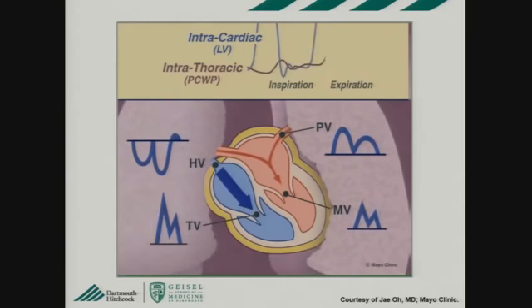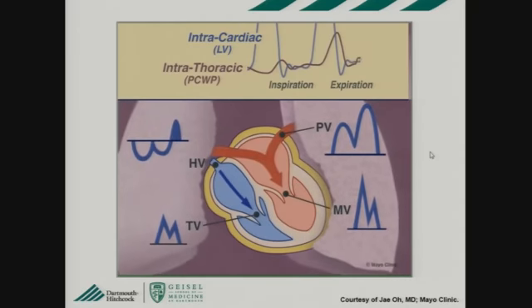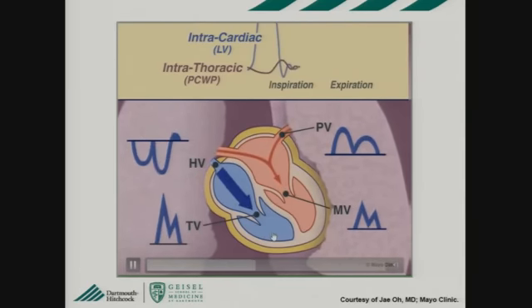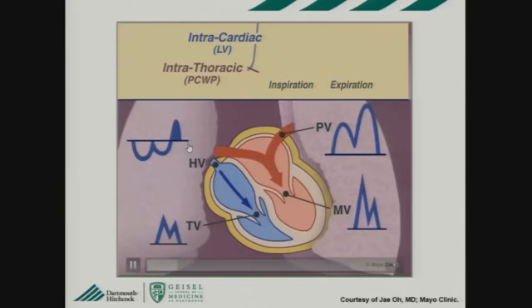So we'll watch this again. Inspiration, expiration. I'll let it play one more time here just so we can see it. Inspiration, drop your left-sided flow, augment your right-sided flow. Exhalation, restore your left-sided flow, decrease your right-sided flow, hepatic vein reverses its flow.